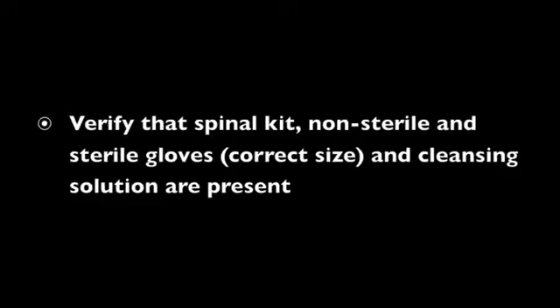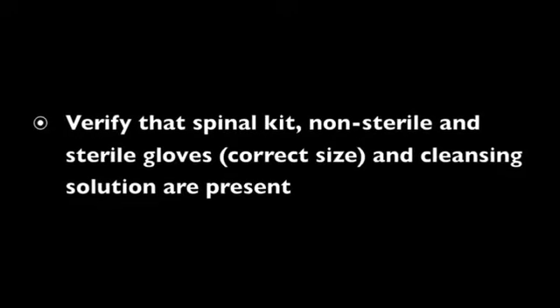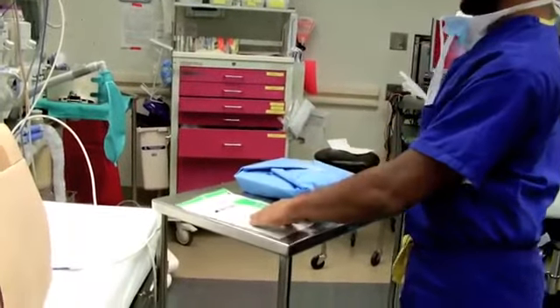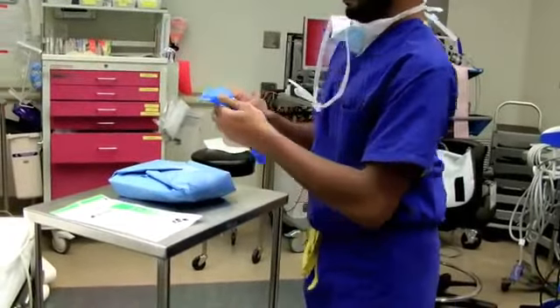Verify that spinal kit tray, non-sterile and sterile gloves, correct size, and cleansing solution are present. Here we have our spinal kit, we have our sterile gloves, our cleaning solution, and our non-sterile gloves.